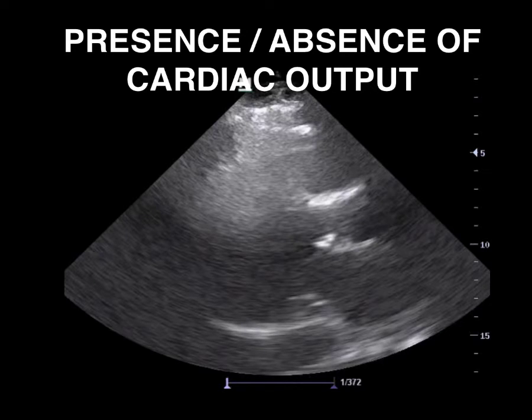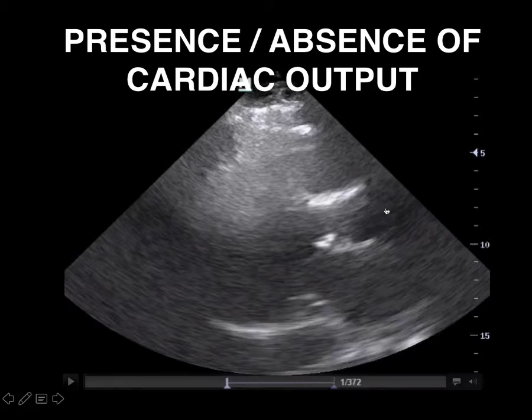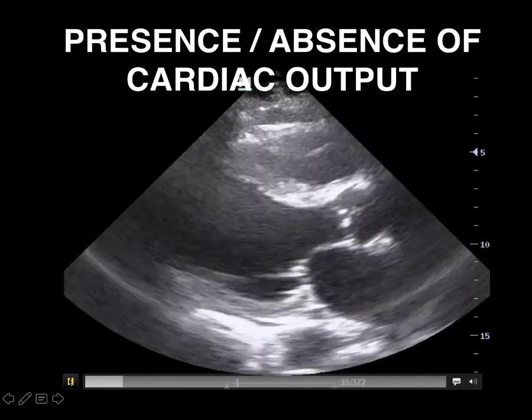On the other hand, we can enhance the specificity of our diagnosis with point-of-care ultrasound in terms of the confirmation of cardiac arrest. How many times have you had a patient brought in by EMS with ongoing chest compressions in whom maybe you didn't need chest compressions? If you haven't been doing enough point-of-care ultrasound, maybe you haven't seen this situation enough. I don't think this video is playing.